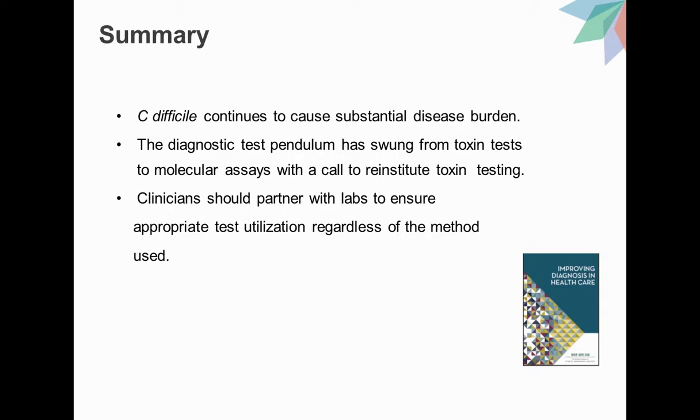In summary, C. difficile continues to cause substantial disease burden. The diagnostic test pendulum has swung from toxin tests to molecular assays with a call to reinstitute toxin testing. Clinicians should partner with laboratories to ensure appropriate test utilization regardless of the test method.